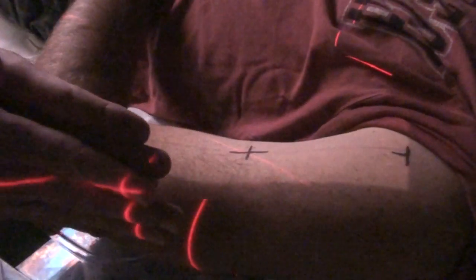What you generally want to do is get all of your marks on the same side of the central ray line. If we started off with the marks spread on opposite sides and just moved the bottom part of the arm until it's kind of on the line and then moved back to the CR, you'd be chasing your own tail. You want all marks on the same side of the CR — the same side of the fence, so to speak. Over-correct yourself; move more than you think you need to. Now all of the marks are on the same side. The driver then goes back to the CR, and we're pretty close — just make a small adjustment.